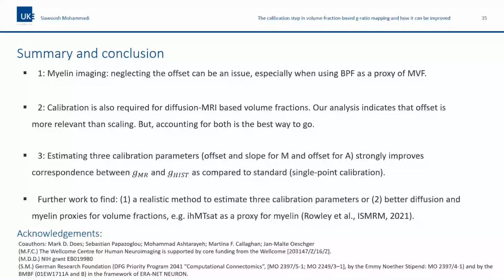Accuracy and the calibration is the only way to make G ratio work, not because the G ratio formalism is wrong, but because what you plug in there is too many things that are site-dependent, fixation-dependent, calibration-dependent.